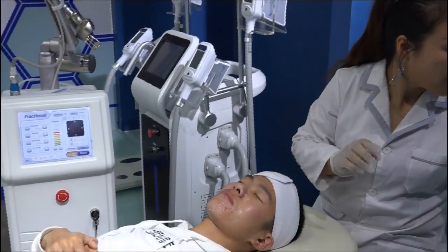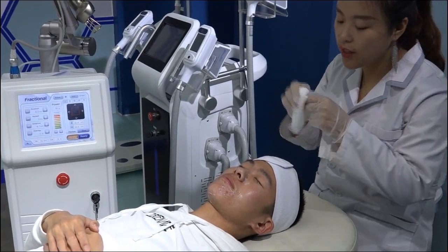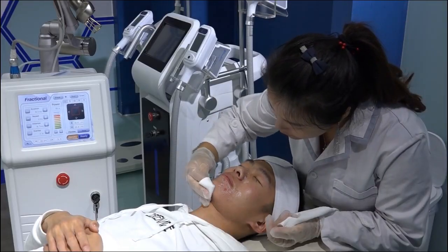Okay. We need to use salt water to clean the face again.